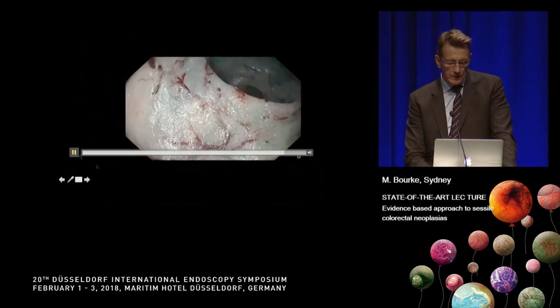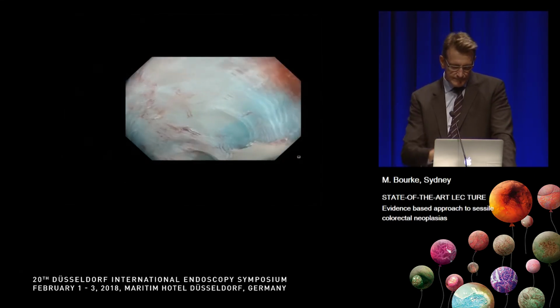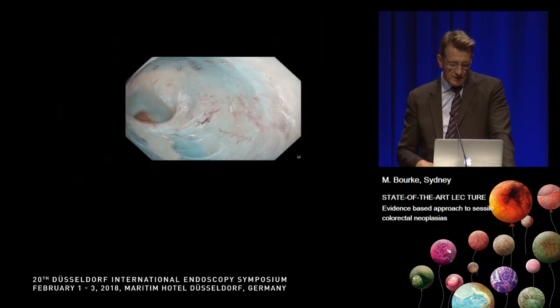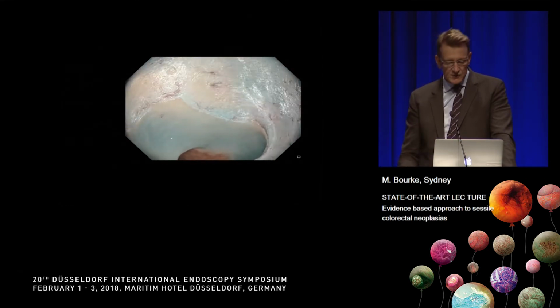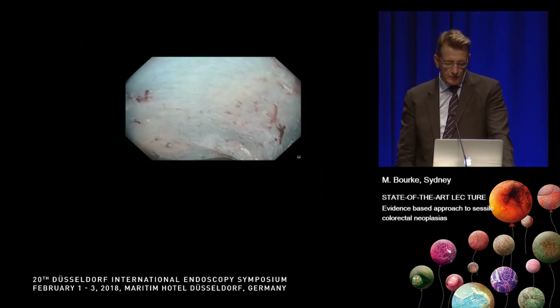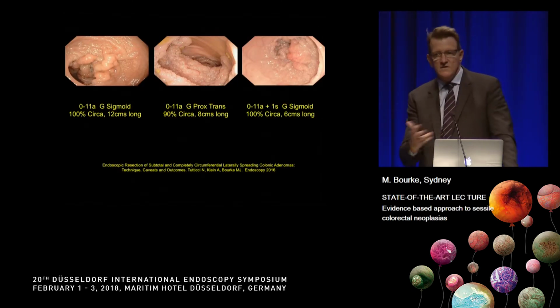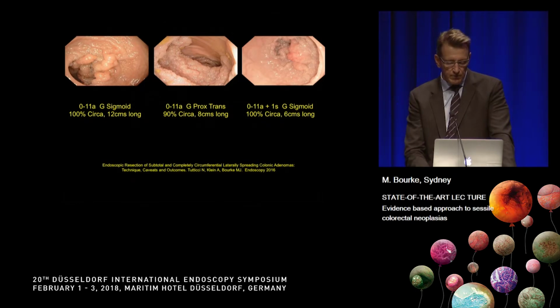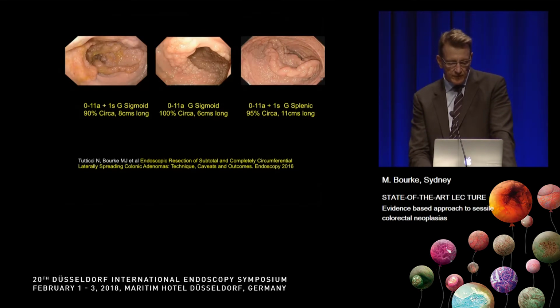So we have a wide mucosal defect extending upwards over about 10 centimetres or so, nearly full circumference, and the patient can actually go home same day or after a single night admission, and these patients don't tend to have recurrence. This is consistently reproducible should you use these simple principles, which are not complex and really can be learned by anyone who's had training in advanced endoscopy.